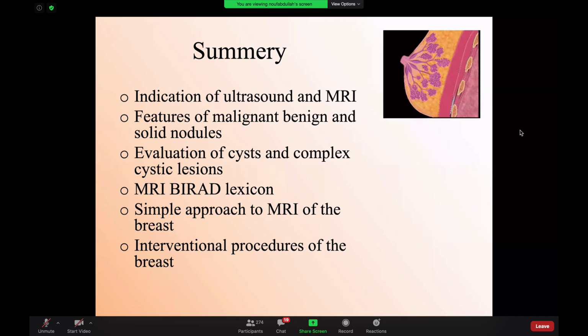Okay. Also, Dr. Abdulaziz asking, is there any additional value of color mapping on MRI? Not really. Color mapping is very similar to kinetic. So if you do the kinetic curve analysis, this would be very helpful because color mapping is very variable depending on the software that you're using.